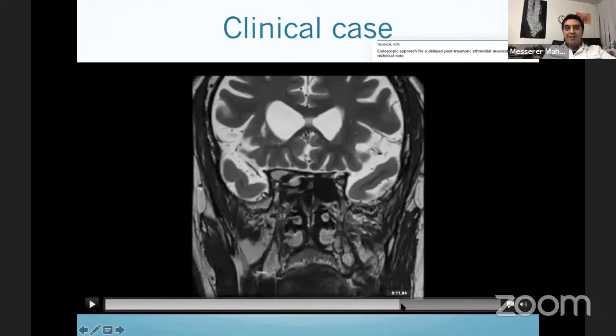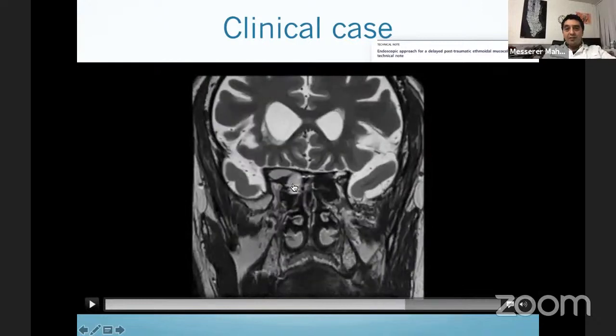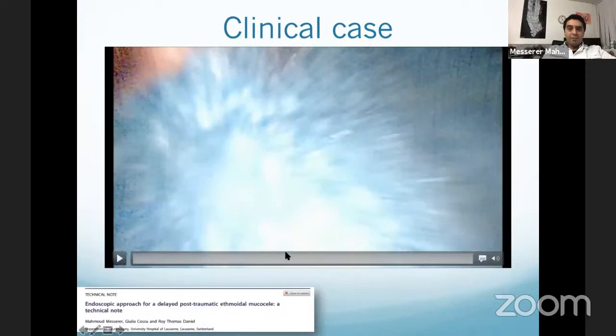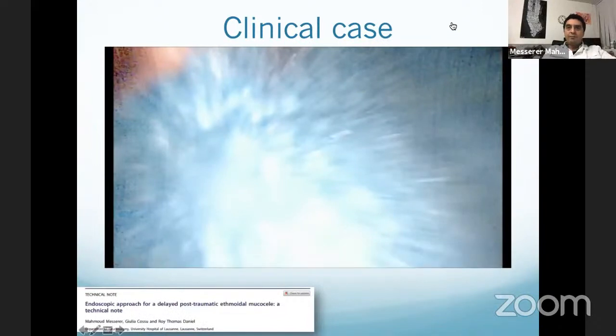the optic nerve is inside your mucocele. This is the optic nerve. And if you don't worry about this particular anatomy, you can damage more easily your optic nerve during your resection. This is a video.